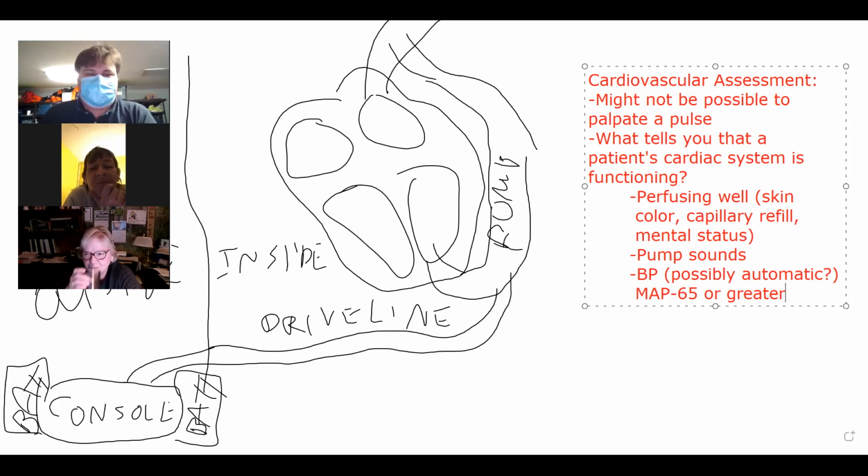I think for there to be an accurate reading, you have to have a pulsatile motion coming through the pulse oximeter, even with the oxygen. Okay. So that's going to go back to what's the patient's skin color? Are they struggling to breathe? Are they cyanotic? And using all of your senses to make a decision about whether someone needs oxygen or not. So pulling all those other tools out.